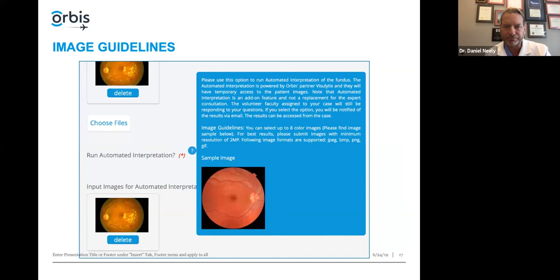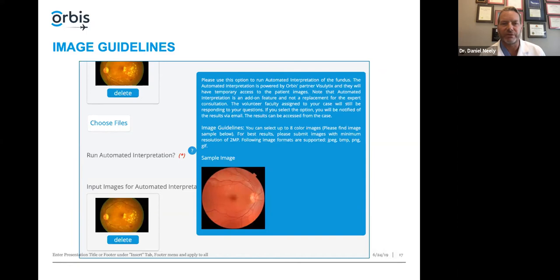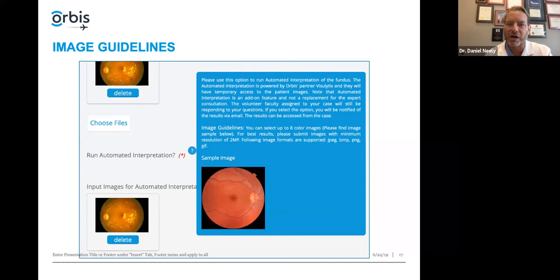There's a little information button — a question mark. It explains: please use this option to run automated interpretation of the fundus. The automated interpretation is powered by Orbis' partner Visualytics, and they will have temporary access to the patient images. Note that automated interpretation is an add-on feature and is not a replacement for the expert consultation. The volunteer faculty assigned your case will still respond to your questions. If you select the option, you will be notified of the results via email, and the results can be accessed from within the case.